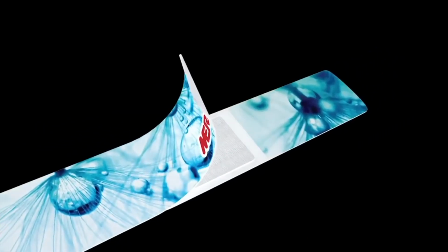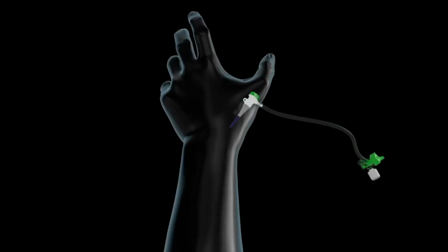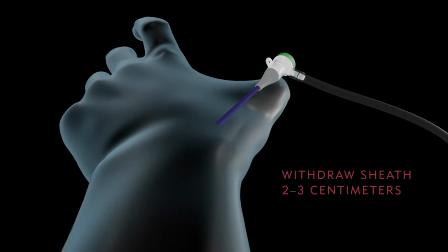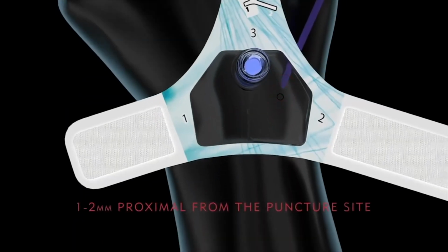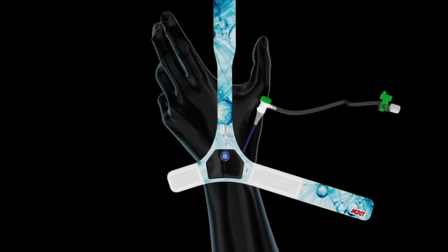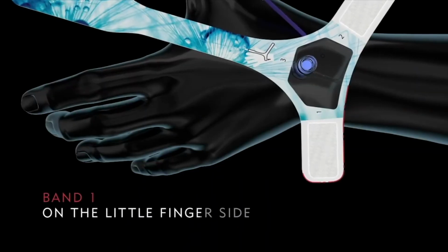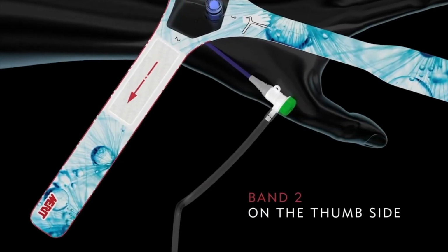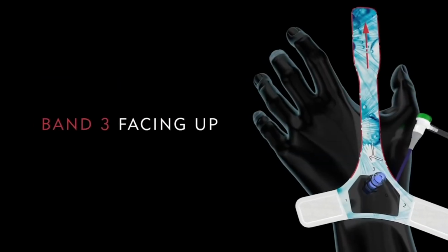For a large patient wrist or hand, you may add the extension band prior to placing the Prelude Sync Distal. Aspirate the sheath and withdraw the sheath back approximately 2 to 3 centimeters. Place the center of the crosshairs approximately 1 to 2 millimeters proximal to the skin puncture site. Place the band on the hand and wrist with band 1 on the little finger side, band 2 on the thumb side, and band 3 facing up toward the thumb.